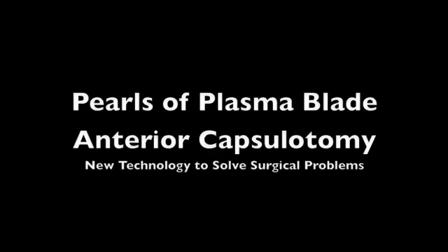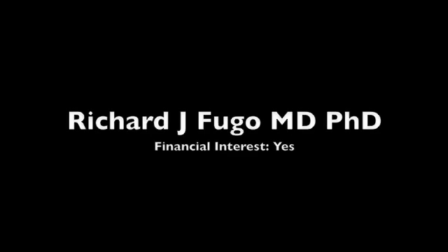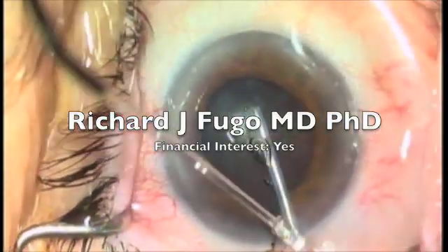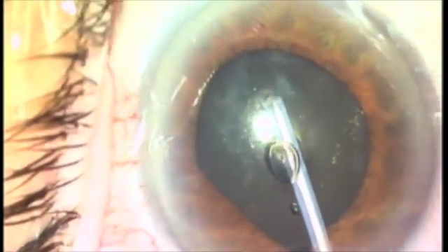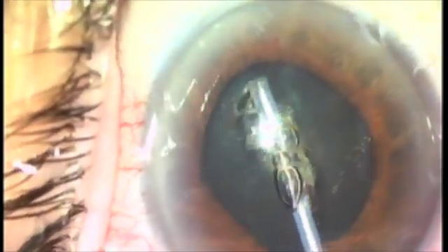We're going to present here a phacomorphic cataract and a floppy iris syndrome, as well as a regular cataract. The floppy iris syndrome patient is one in which I've stretched the iris, and now I'm going to start my capsulotomy.